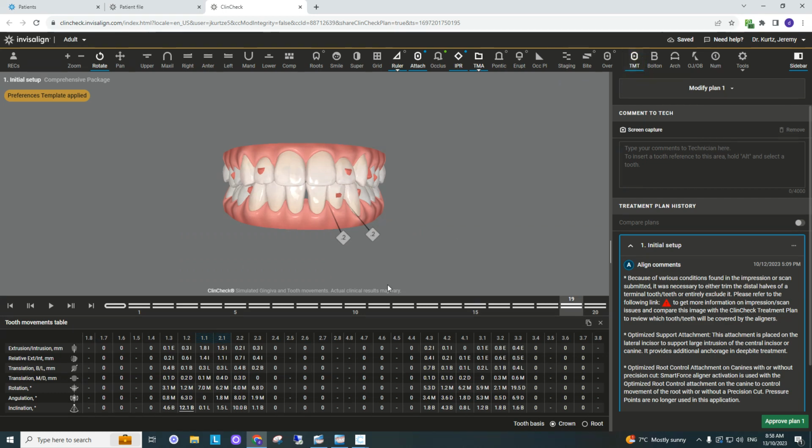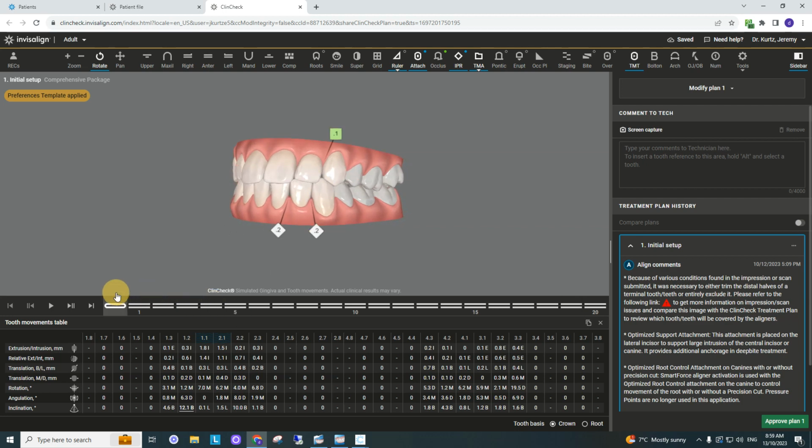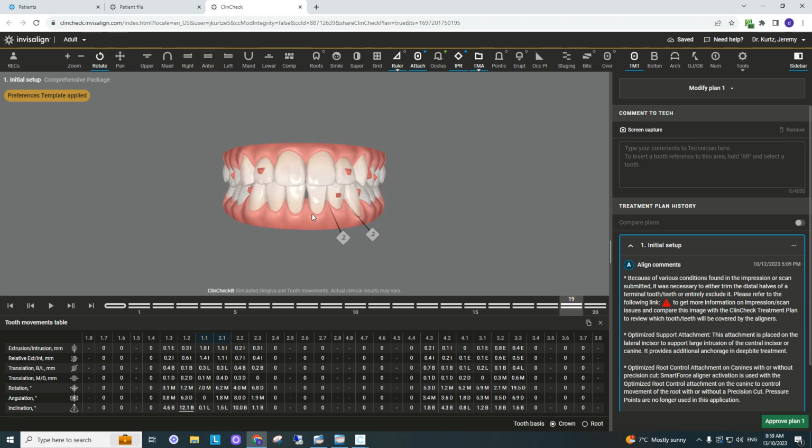And then also I'll pull up the tooth movement table if there's anything significant, so I can see that the anterior teeth here, 11 and 21, were intruded about 1.8 millimeters. So I want to make sure that I have the attachments that are there to support them. And they have these optimized deep attachments, not bad. Sometimes I'll put a secondary attachment, as you'll see. And on the bottom, they've actually done a little bit of extrusion of this lateral incisor as opposed to intruding the front two teeth, which I think probably could use a little bit of intrusion to level the edges, and then we'll need some attachments to support that.